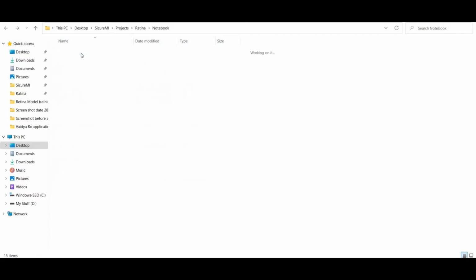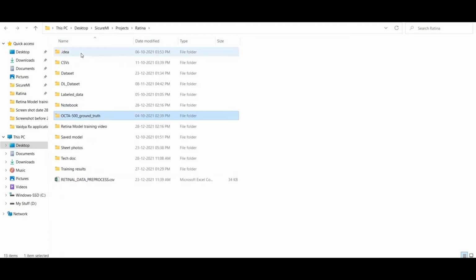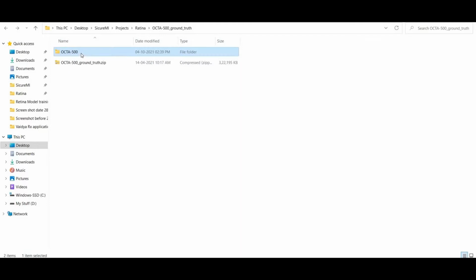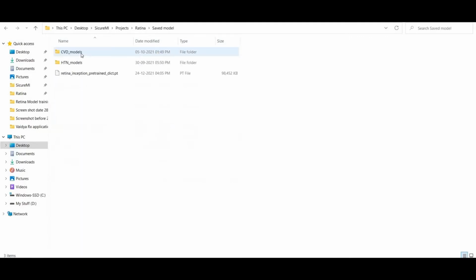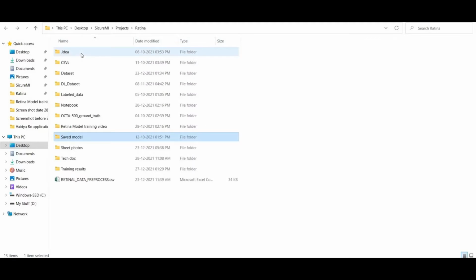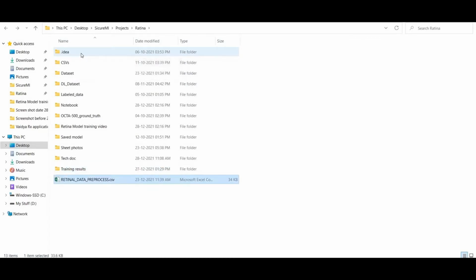5. The notebook folder contains all the notebooks required for the training of the model, and the archive folder contains the backup of the master notebook. 6. Octa 500 data folder set contains the extra data set. 7. Retina model training folder contains videos and files related to the model training video. 8. The saved model folder contains the model saved after the training of both CAD and hypertension models. 9. The sheet photos folder contains the sheet photos we get from the Center for Sight while data collection. 10. The tech doc folder contains all the technical documents of the project. 11. The training results folder contains the record of the training of both the CAD and hypertension models. 12. Finally, the retinal_data_preprocess.csv file contains the patient data and their medical conditions.